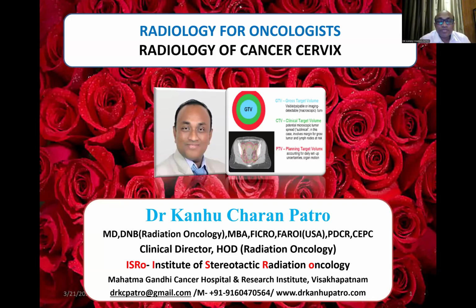Good evening, everybody. Today, I am going to discuss the radiology of cancer cervix, which will help you understand the surgical evaluation as well as the target delineation for the radiation oncologists.